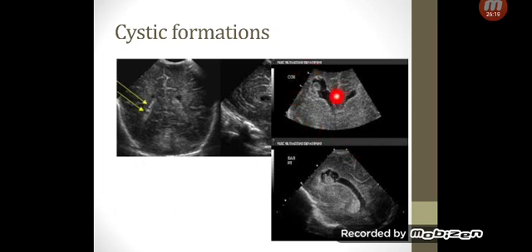This here is a cyst that got formed because of a blood clot, so it's post-hemorrhagic, and you can see the blood clot there. There was a hemorrhage that got the ventricle a bit dilated, but then formed a cyst in the extension here, which might denote ischemia. So this one you could be concerned about.